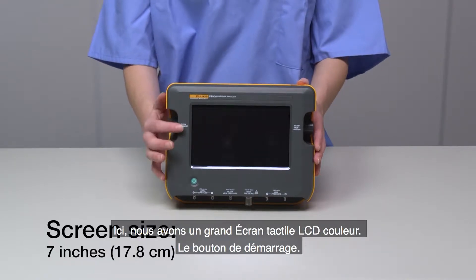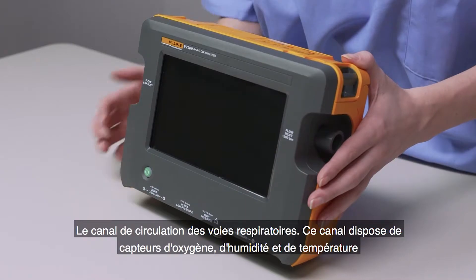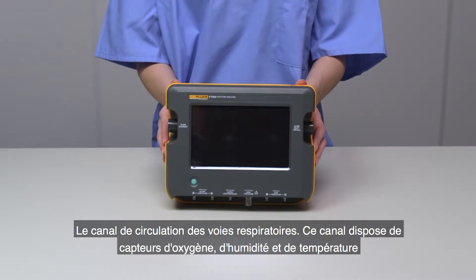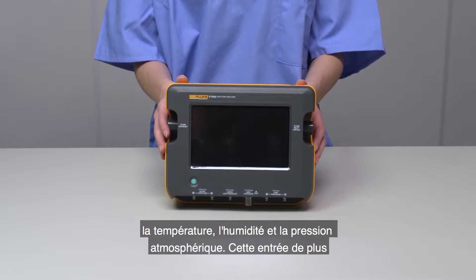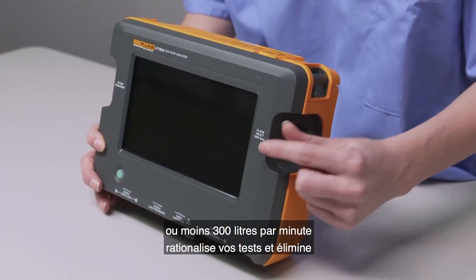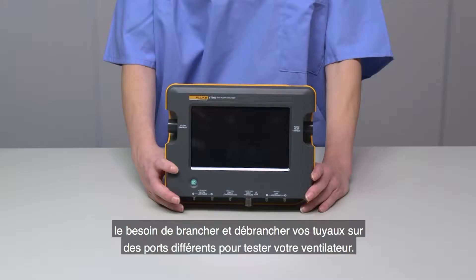Here we have a large-color LCD touchscreen, the ON button, and a single-flow airway channel. This channel has oxygen, humidity, and temperature sensors built in line. It automatically compensates for temperature, humidity, and atmospheric pressure. This channel is full range, plus or minus 300 liters per minute, which streamlines your testing and eliminates the need to hook and unhook hoses to multiple ports for your ventilator testing.